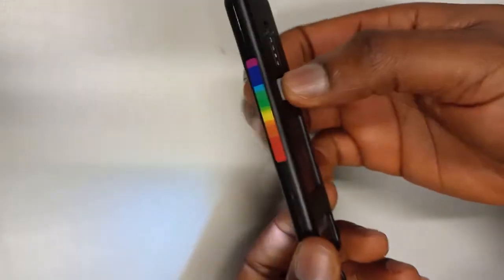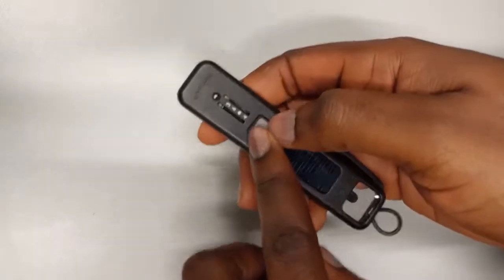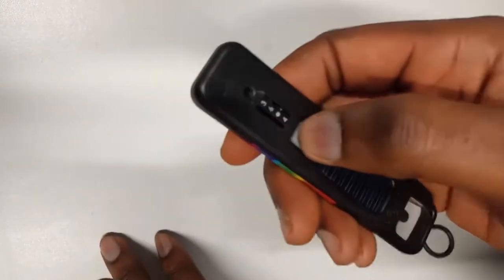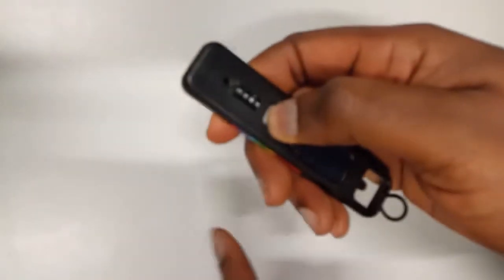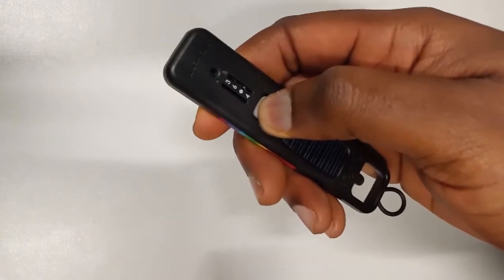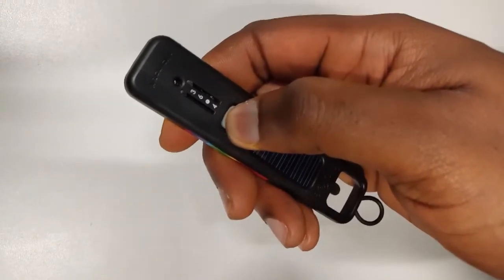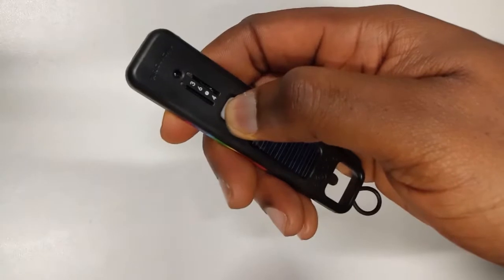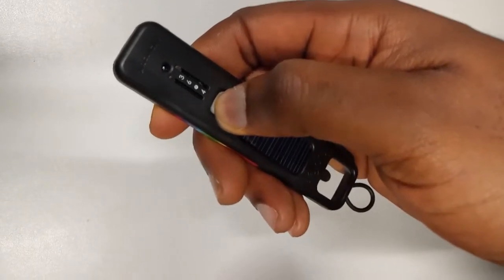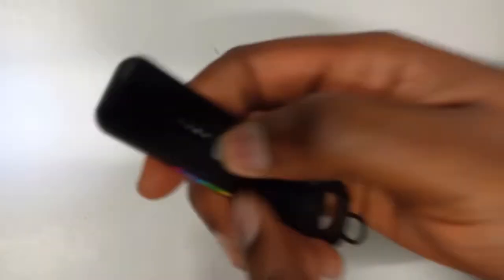So you turn it off by clicking the power switch — it goes off — then you hold down the power switch for 15 seconds. You hold it down and count to 15. After 15 seconds you release it, the light blinks, you click once again and one light comes on.